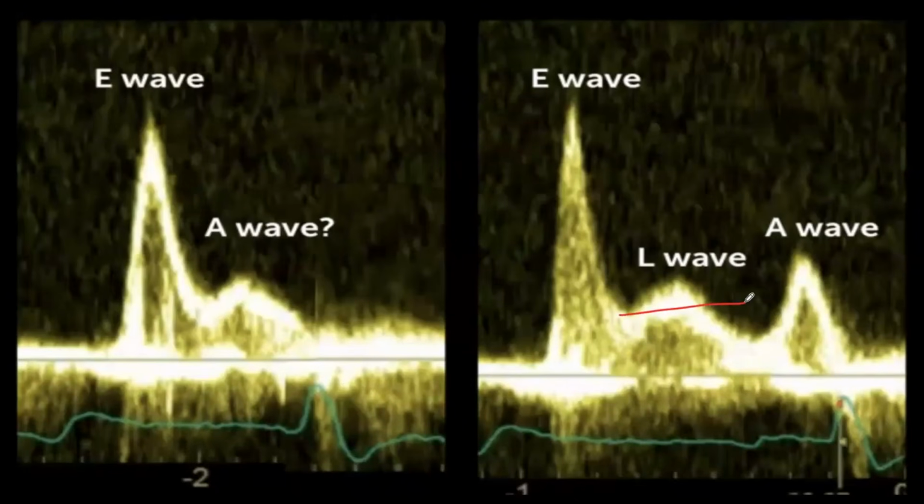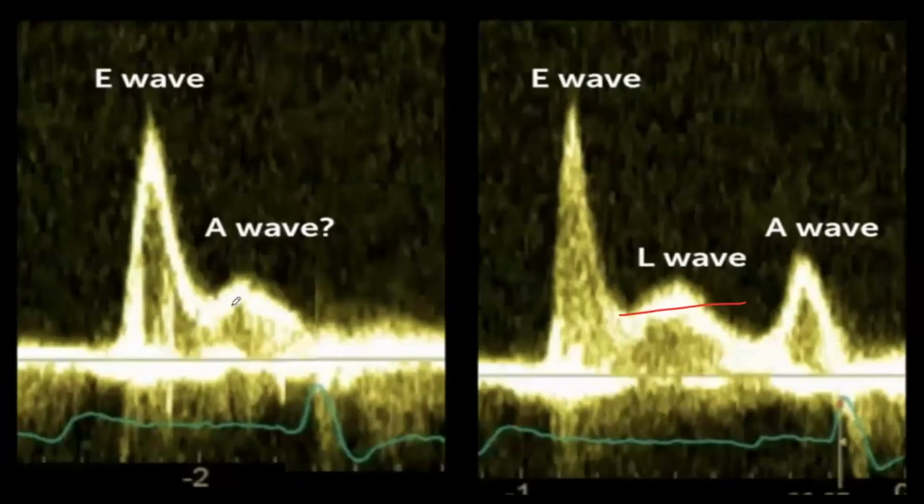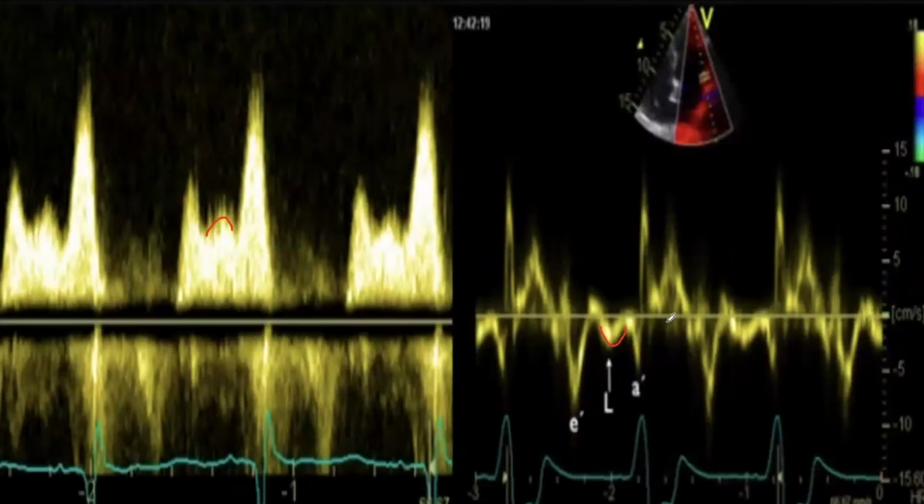And if you didn't recognize it at this moment, you still have a chance. Echo gives you a second chance, a second reminder, that you still have the tissue Doppler. This is the same reflection, by the way, in the middle, that the LV is still expanding, still receiving blood. This time is the time of diastasis, supposed to be empty or no significant flow. Whenever it exceeds, you can see it sometimes if the patient is very brady. However, we never diagnose a patient's condition from one image or two images.